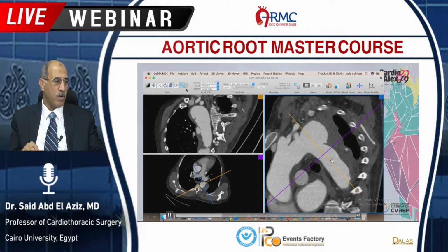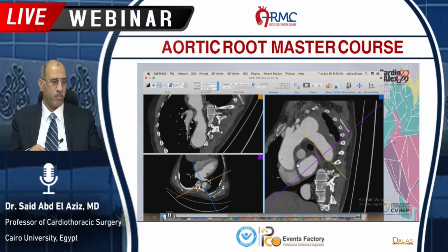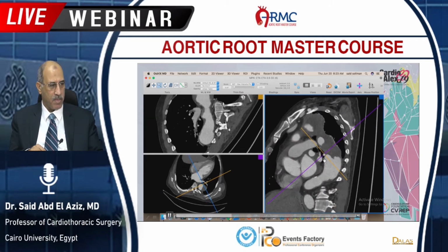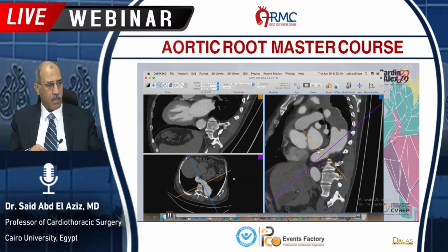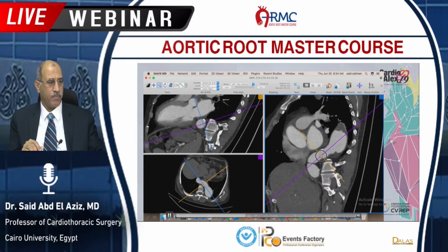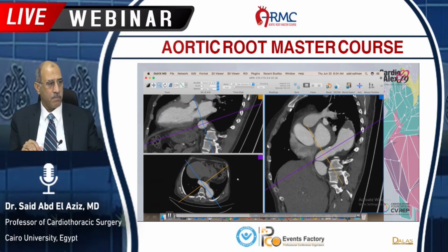After that, we go to measure the distal landing zone. We measured the proximal landing zone, then we go down to measure the distal landing zone. We will move this here, yes, like that, and put the axis along the axis of the aorta, so we can get a circle to measure properly the size of the stent. Here we will size this circle.